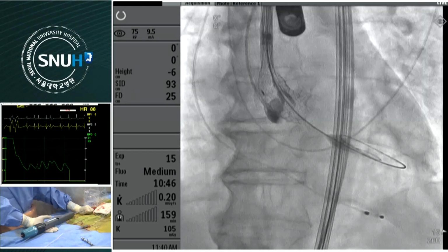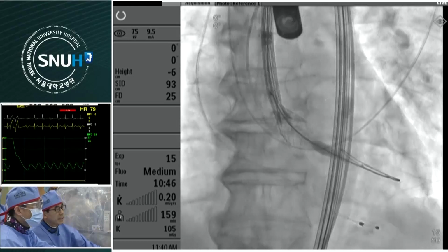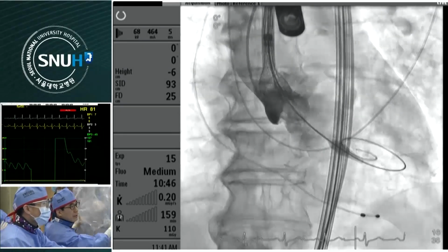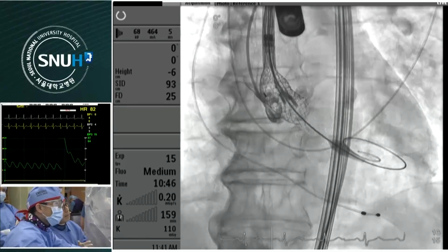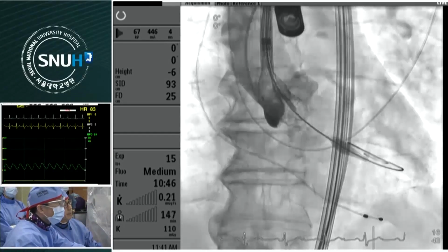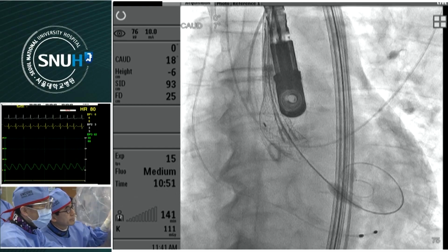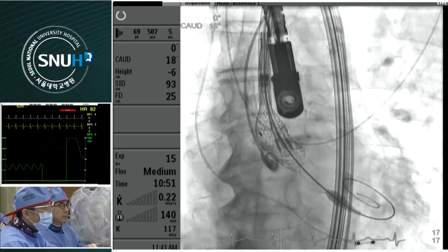A little bit high on the right side. Okay. Just push it, please. Do we have to capture? No. Just push it. I'd like to make the three posts at a single plane. Okay. Stop. Snap once again. It's acceptable.